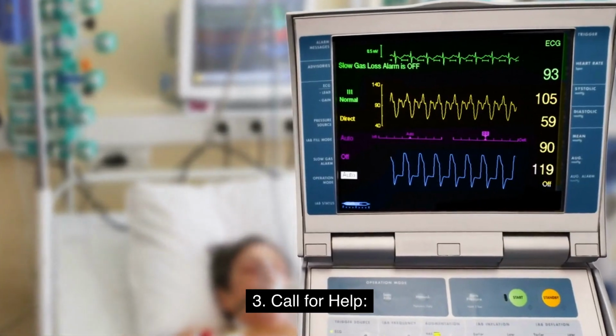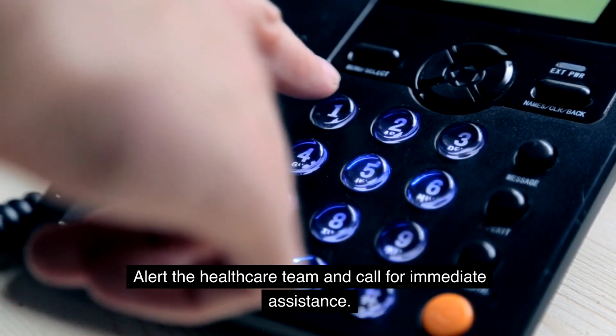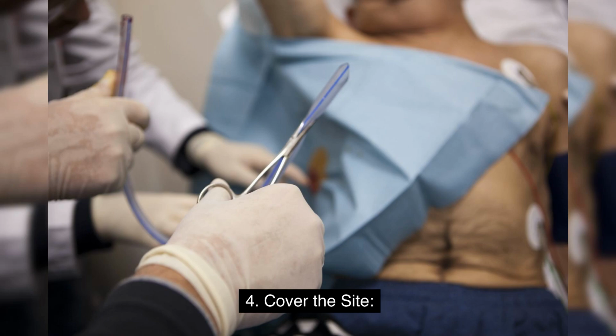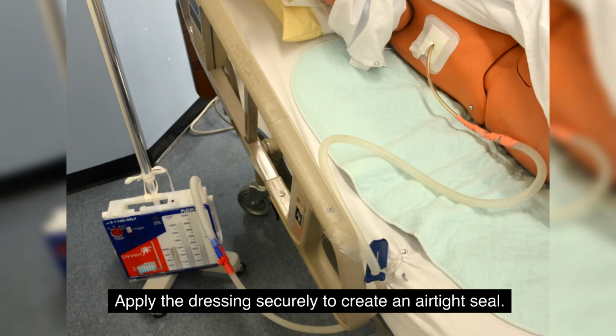3. Call for help. Alert the healthcare team and call for immediate assistance. Inform the physician or surgeon who placed the chest tube about the situation. 4. Cover the site. Use a sterile occlusive dressing or petroleum gauze to cover the stoma, the opening where the chest tube was inserted, to prevent air from being drawn into the pleural space. Apply the dressing securely to create an airtight seal.